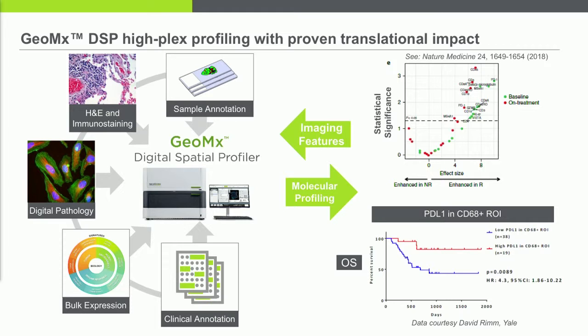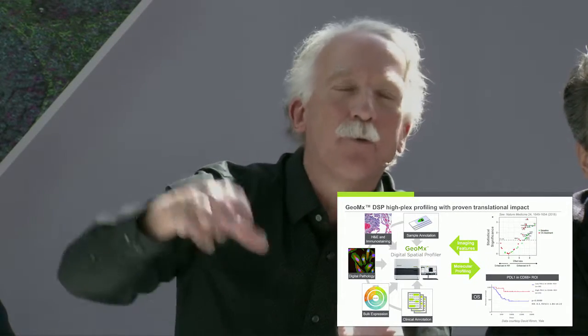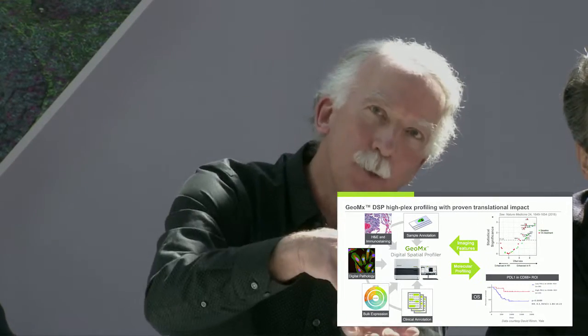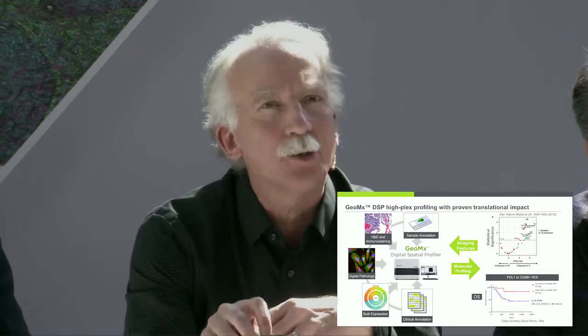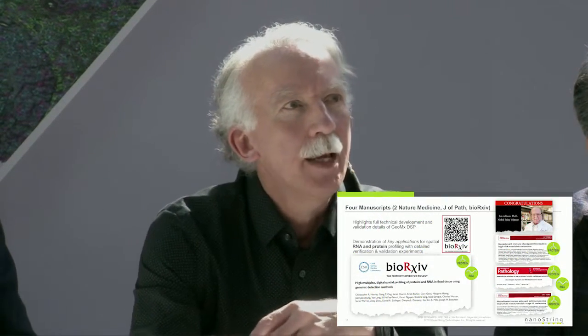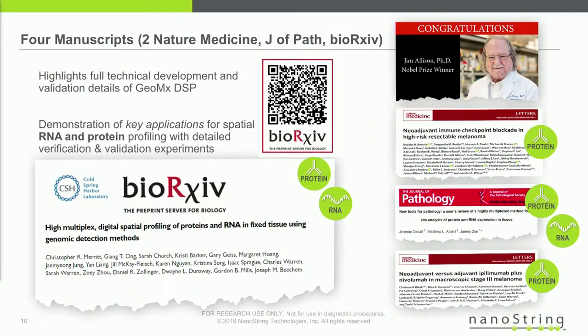And when you do that, it'll automatically take you back to the raw images that generated that data. So you can always go from profiling into the tumor again and back and forth. This was a key aspect of the way we designed the software for the system. Now, this is a reasonably mature system now. I've been talking to you, especially from the protein side.